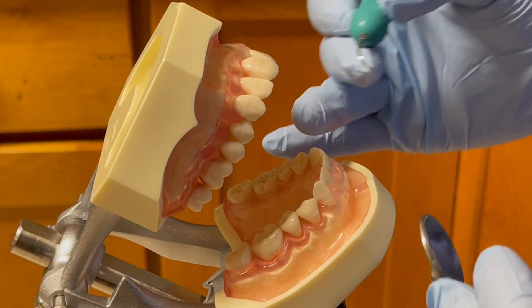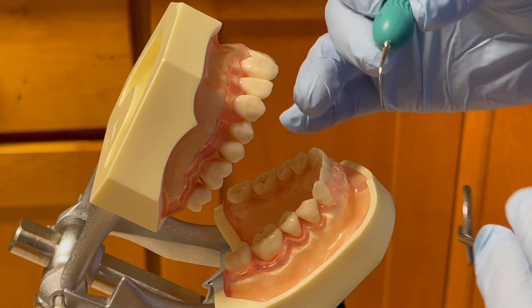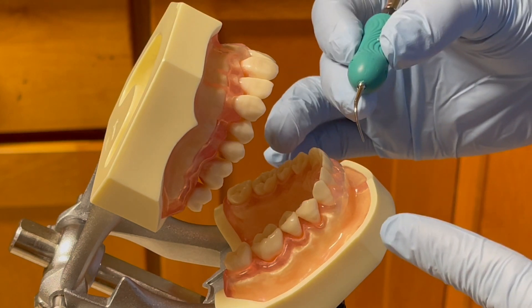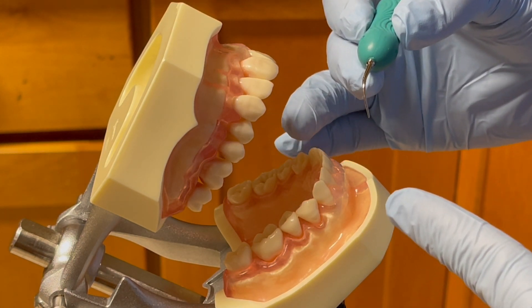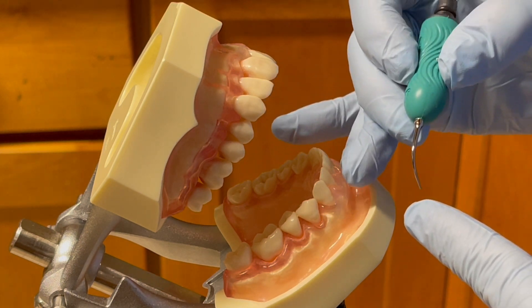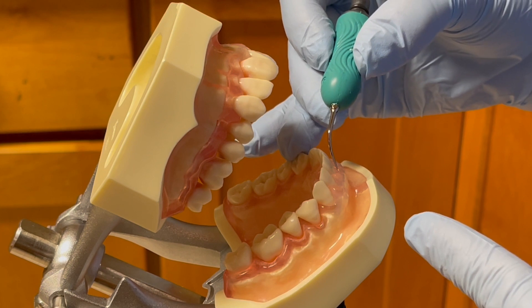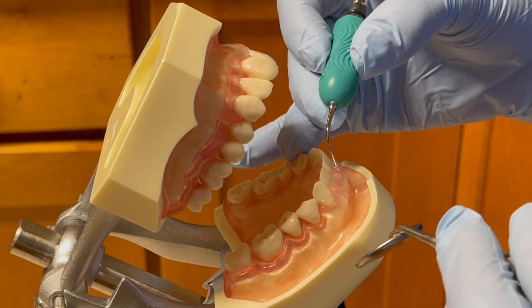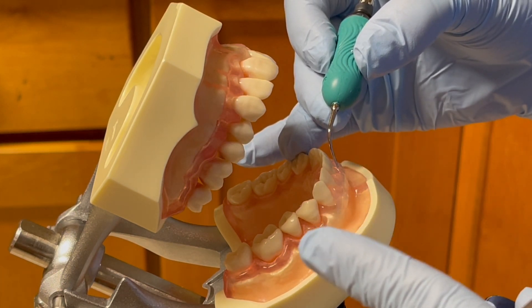Now I will use the straight slim insert for demonstration. It is used in a low power setting for removal of light to moderate calculus and plaque biofilm. I will start with numbers 25 and 26. For the facial aspects of 25 and 26, I will be sitting at 8 to 9 o'clock with the patient in supine position.